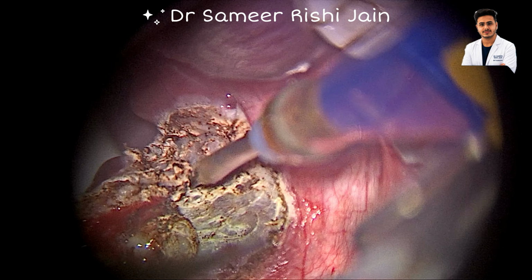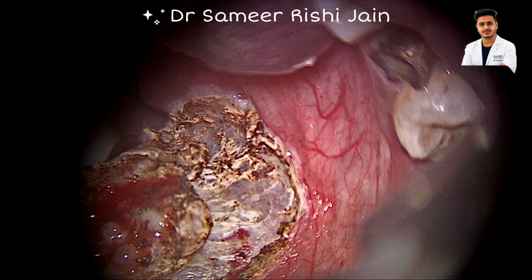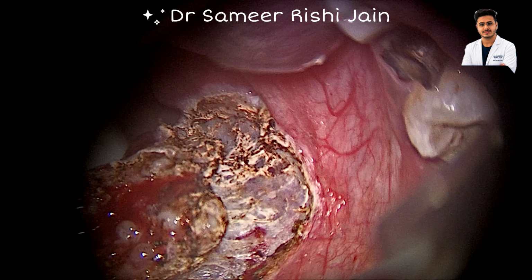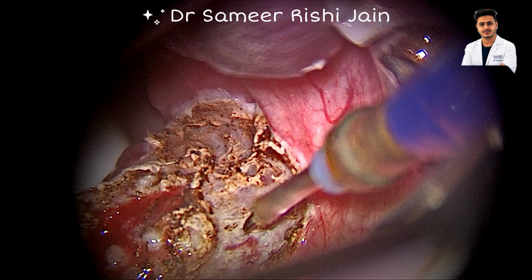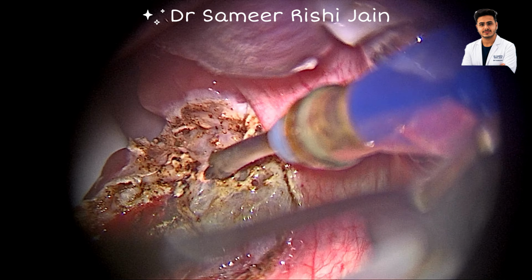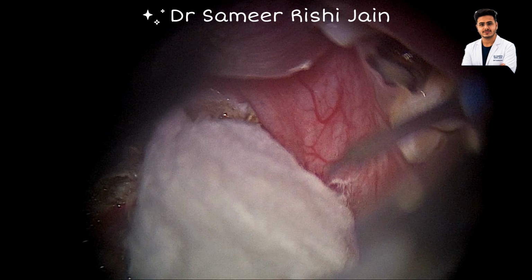We don't have to incise the muscle, which will lead to exposure of the muscle and later on myositis, which is a cause of pain in the post-operative period. I am making the tissue more wet so that the monopolar cautery also works properly and I can get a better differentiation of the colors.